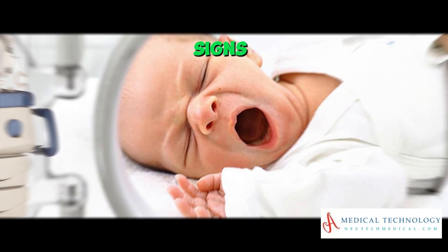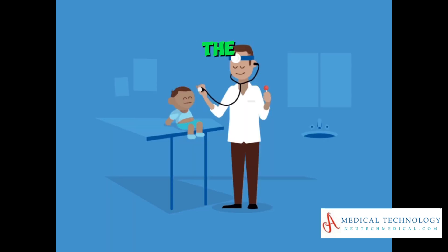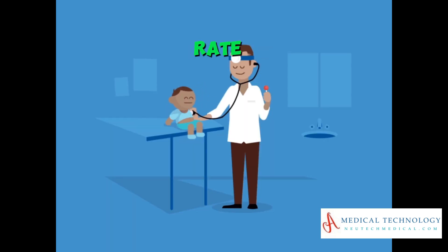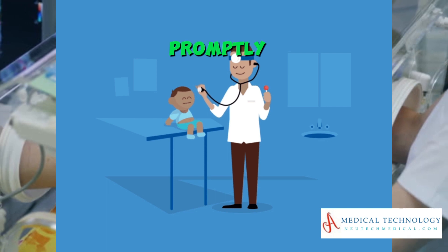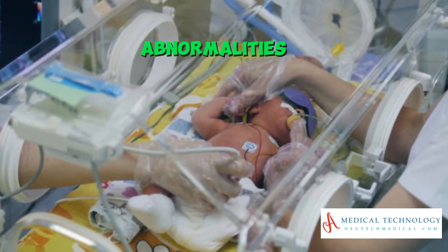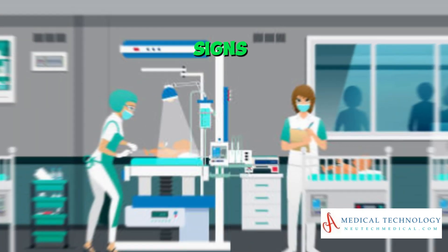Monitoring vital signs: Regularly check and record the infant's heart rate, breathing rate, and oxygen saturation. Respond promptly to any alarms indicating abnormalities in vital signs.